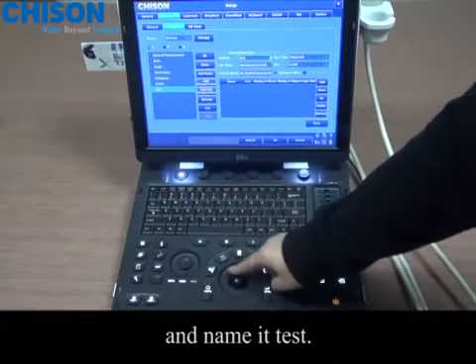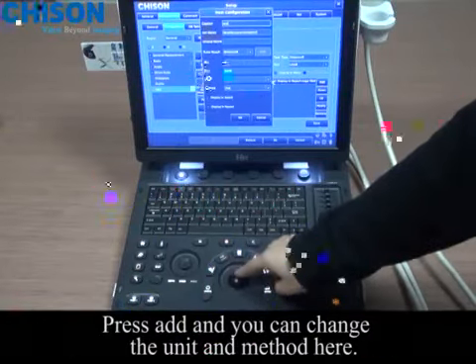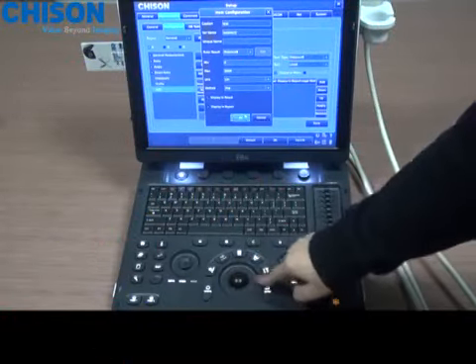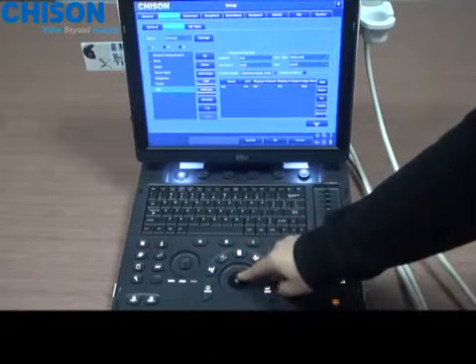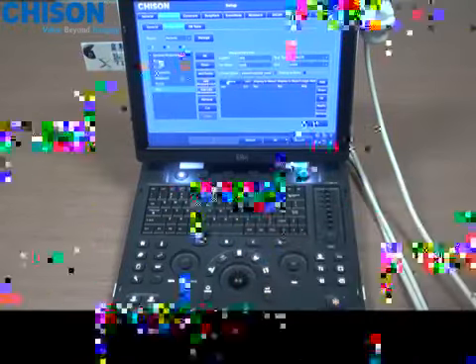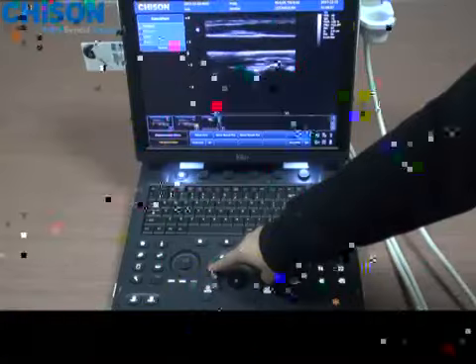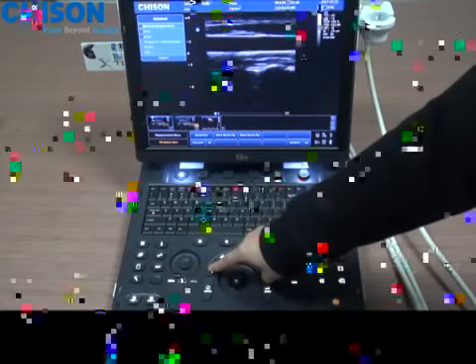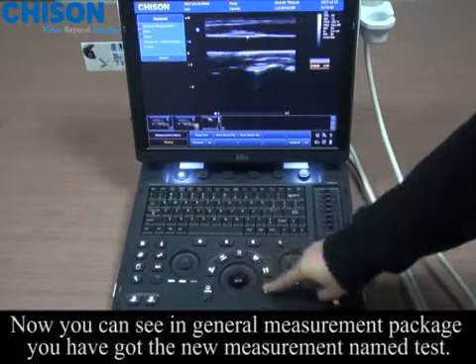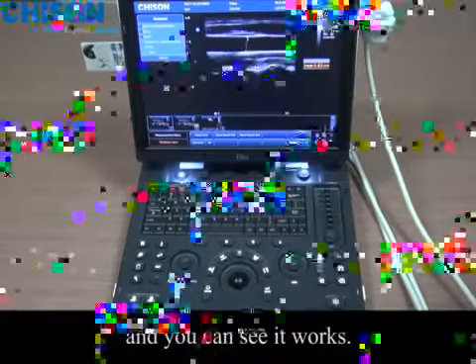Name it 'test', press add, and you can change the unit and the method here. Press save and wait a few seconds. Now you can see in the general measurement package you have got the new measurement named 'test', and you can see it works.